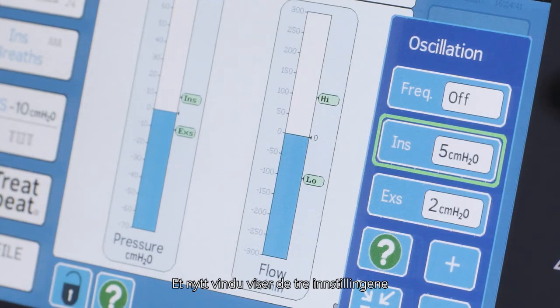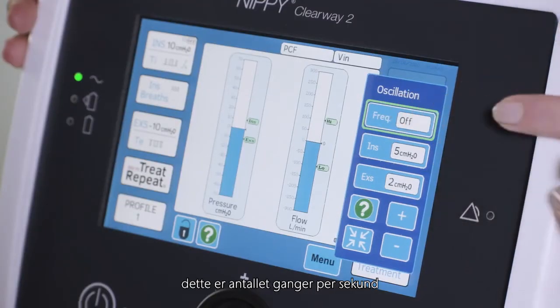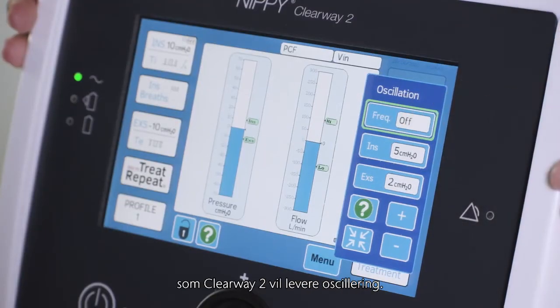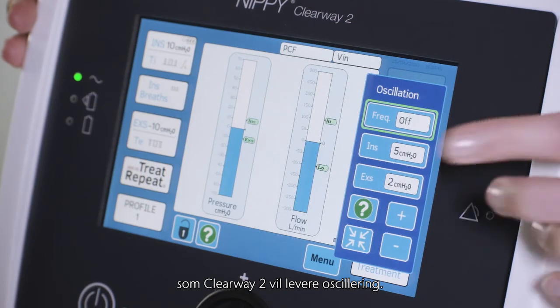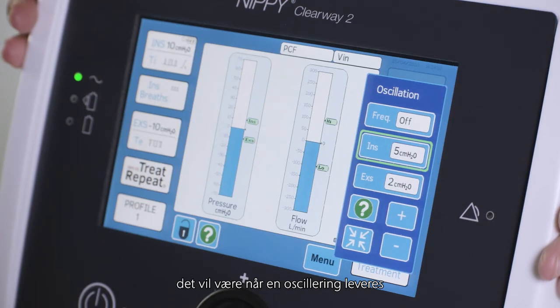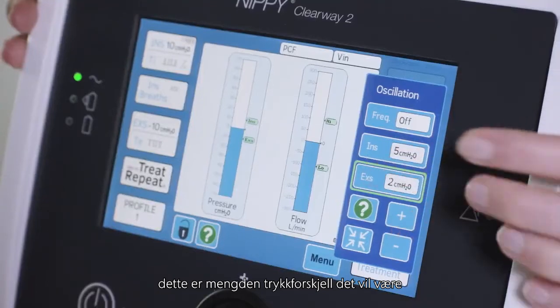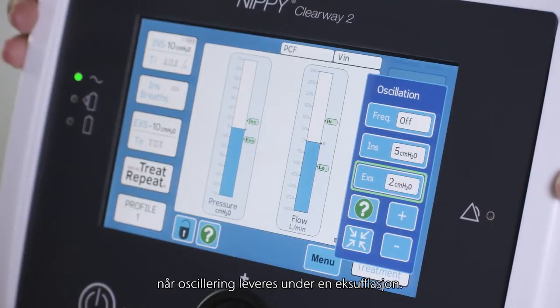A window will appear showing the three settings that can be changed to use oscillations. Frequency: this is the number of times per second that the Clearway 2 will deliver oscillations. Inns: this is the amount of pressure difference there will be when an oscillation is delivered during an insufflation. X: this is the amount of pressure difference there will be when an oscillation is delivered during an exsufflation.